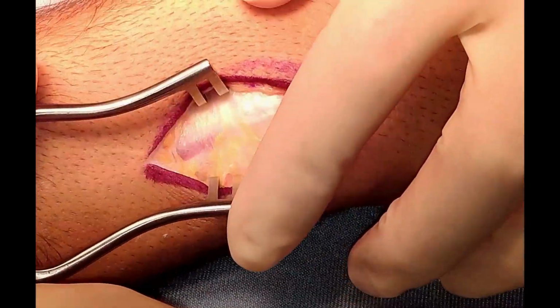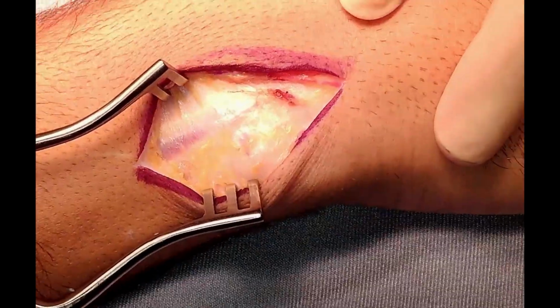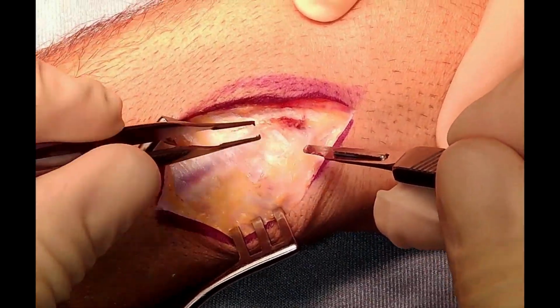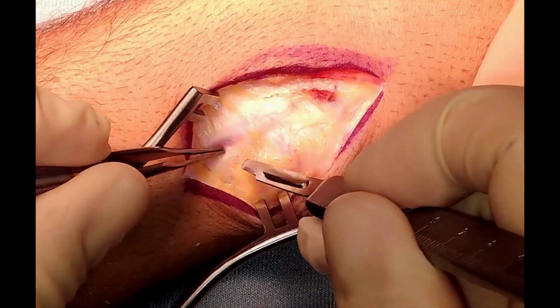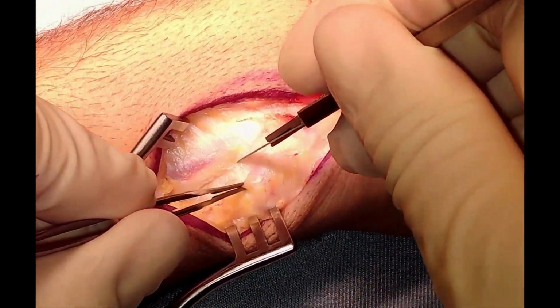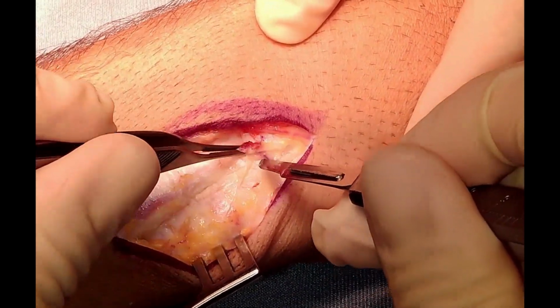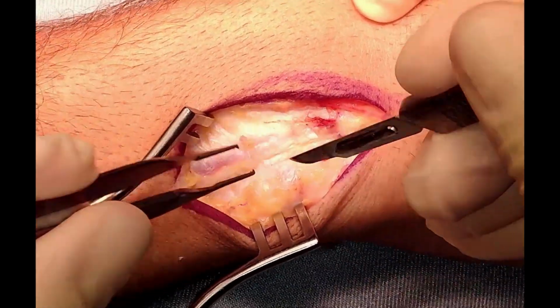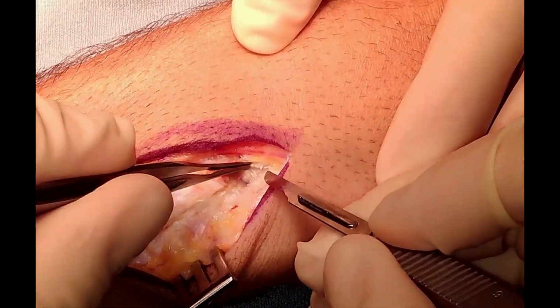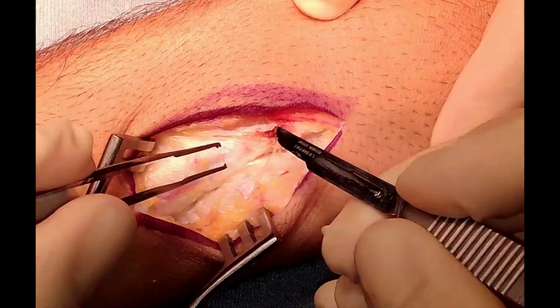So as we have seen in the MRI, there is a ganglion cyst that is under the fifth compartment, pushing away the ECU, causing some symptoms of pain with instability with this young patient. This is a unique case, as we are going to stabilize the ECU from a dorsum approach on the radial side of the ECU.